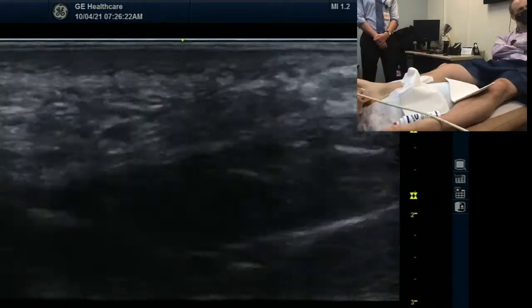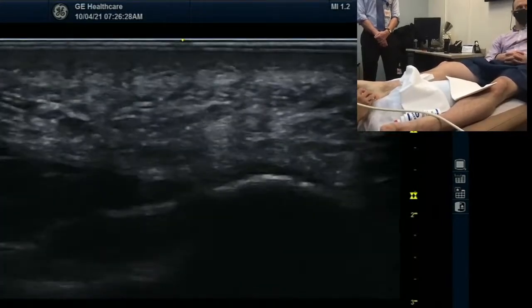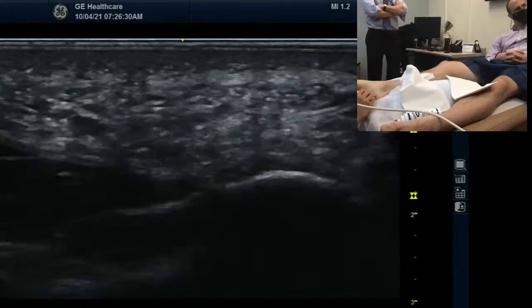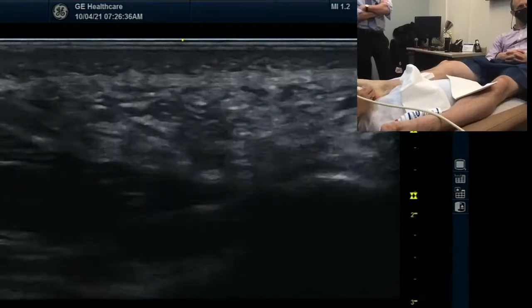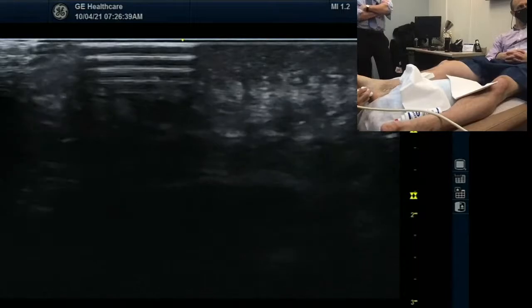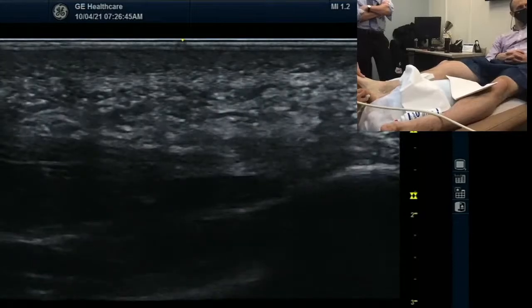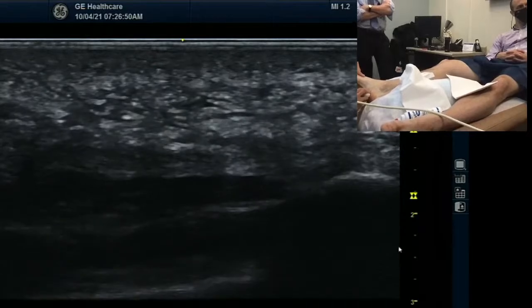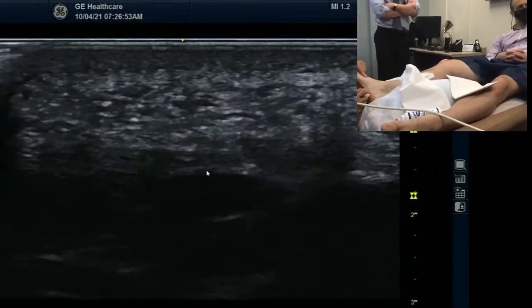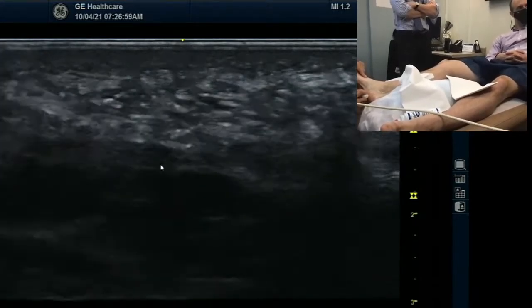Do you want to narrow it while you're doing? Yeah, I'm going to narrow it while I go down. So now I'm at his calcaneus, the inferior border. I'm at the medial facet of his calcaneus. Looking at his plantar fascia. Let's find the plantar fascia. Usually it's hard to get the nice view down. I'm trying to do the toggle. I'm sure you're getting a lot of shadowing. Is this the fascia? Yeah, that is the fascia. It's the plantar fascia. I'm at the central corner of it now.